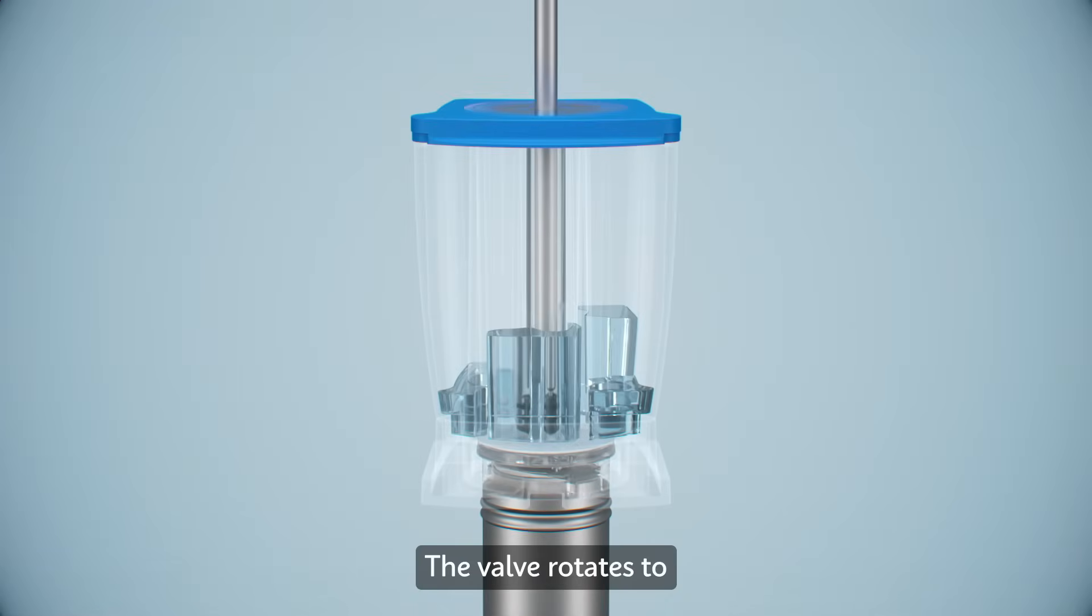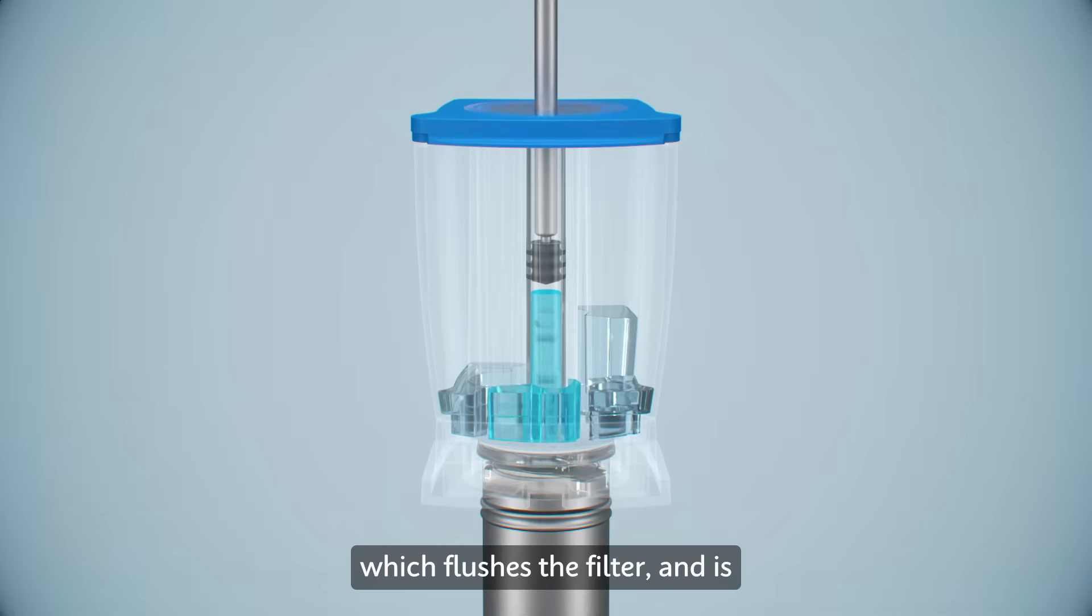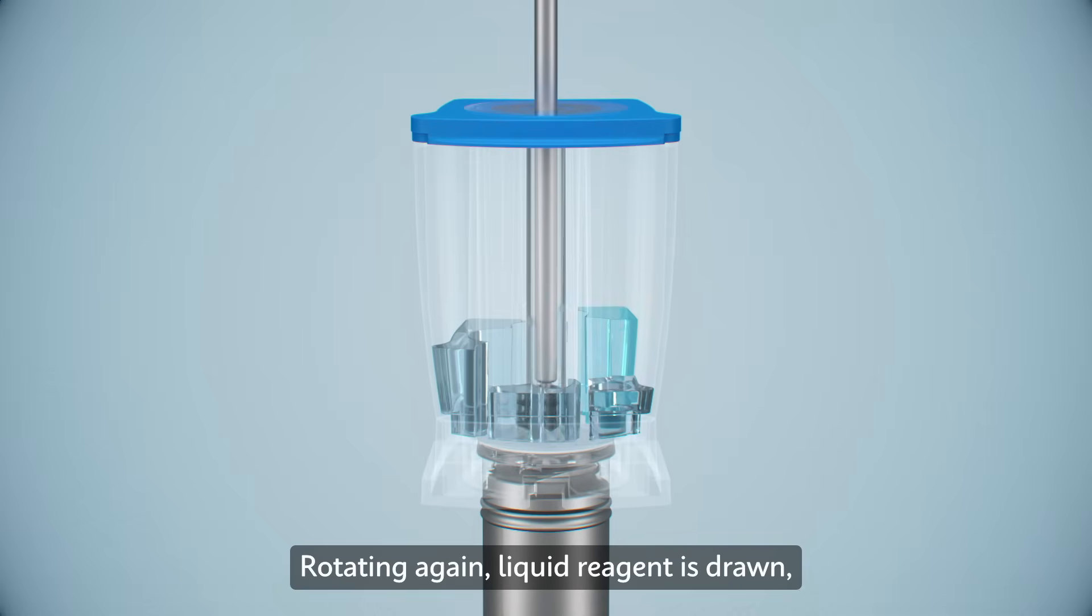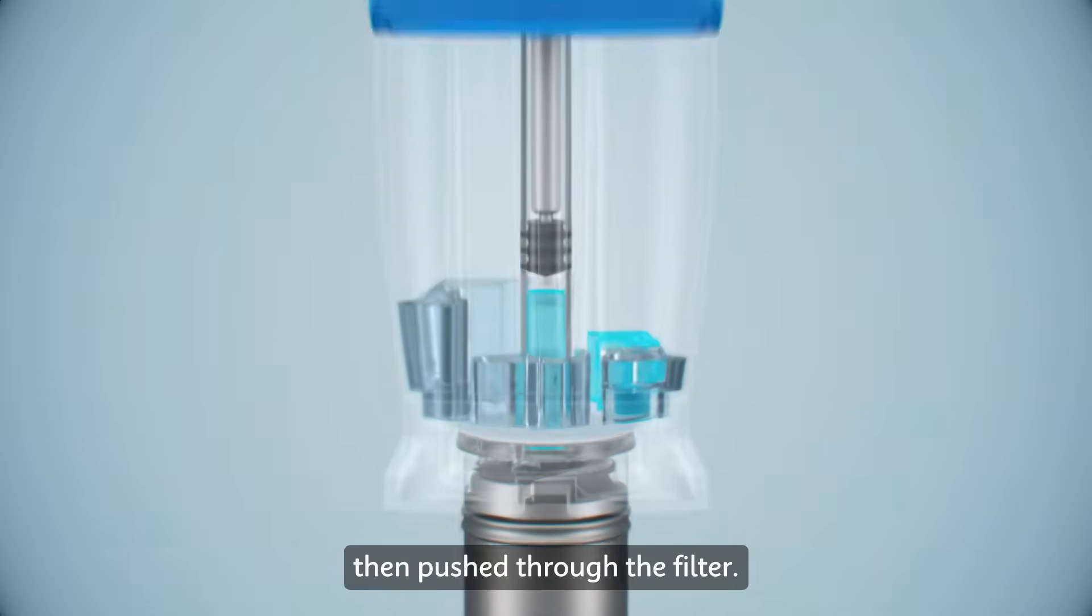The valve rotates to draw in wash fluid, which flushes the filter and is collected in the waste chamber. Rotating again, liquid reagent is drawn, then pushed through the filter.